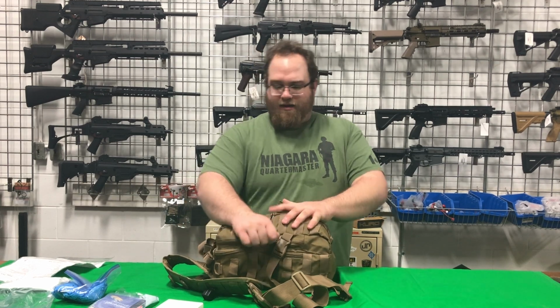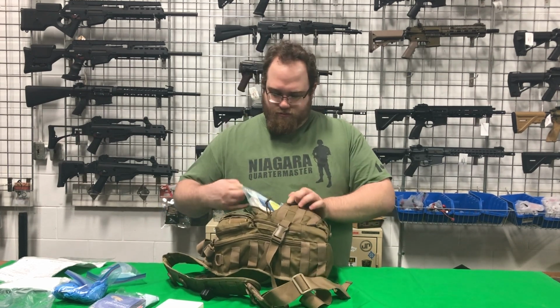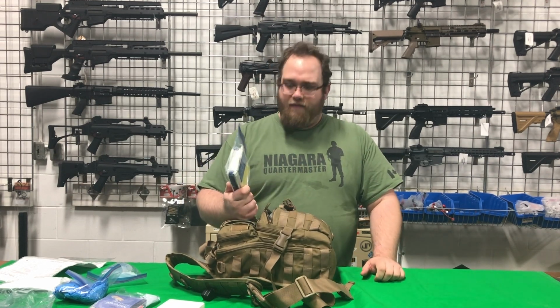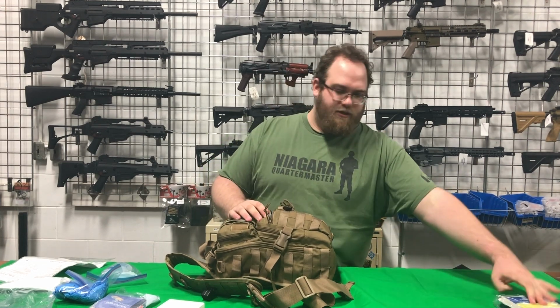Now in this packet here, I've got some eye wash. This is for major trauma. This is a chest cavity wound patch. This one opens up and is actually designed to stop a bullet wound. This is for a much bigger purpose.